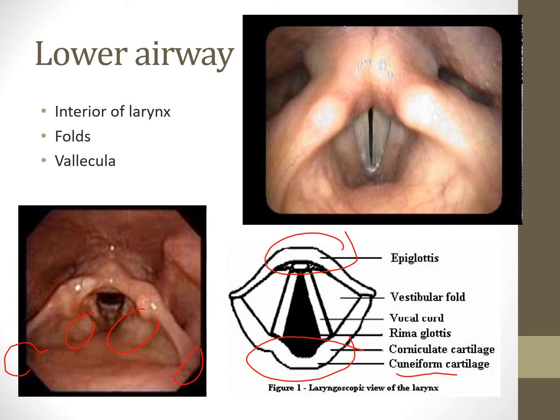It's really neat, and if you're at a facility that's very progressive with respiratory therapy, it will help you do more intubations and see a better structure support of the airway. So make sure you identify your landmarks. If you're doing intubation, make sure you see all your landmarks.